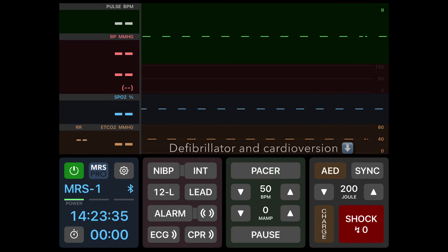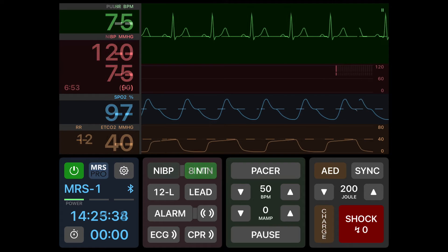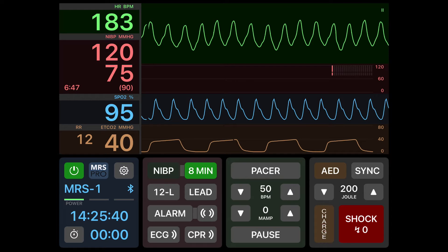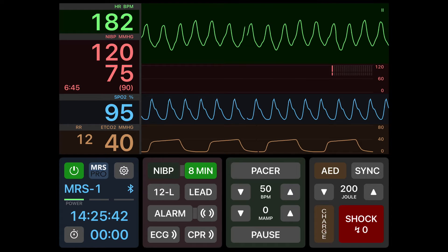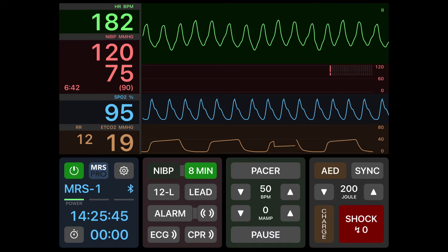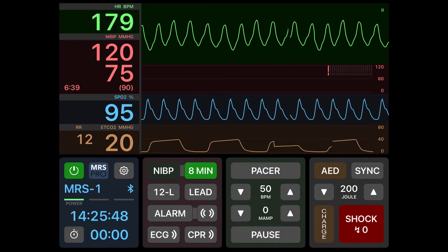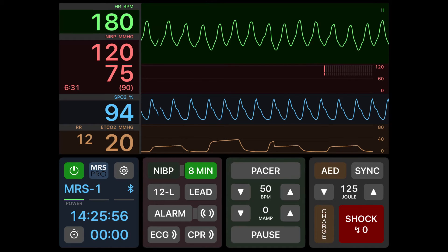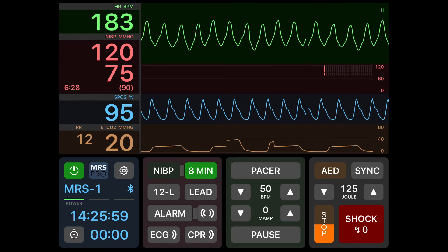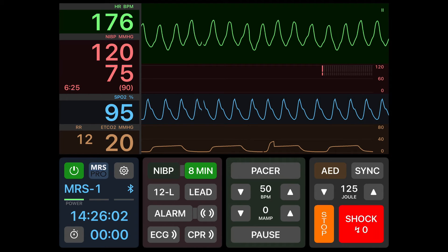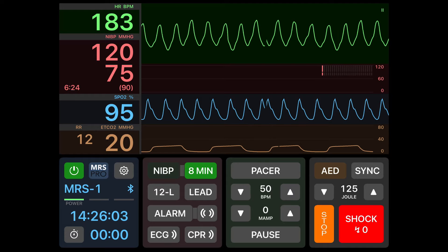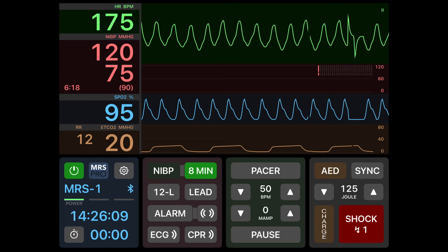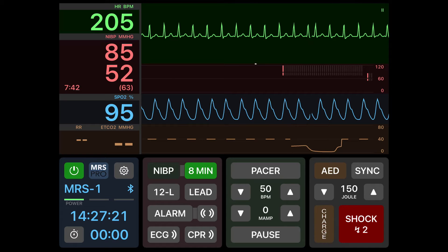To the right of the pacing section is the defibrillator and cardioversion controls. To use the defibrillator in AED mode you would push AED. Otherwise you will manually change the energy selection by pushing the up or down button. Once you select your energy for defibrillation, hit the charge button. If you make a mistake, you'll notice the charge button becomes a stop button. If you have the correct energy selection, push and hold the shock button. You'll notice that once you push the shock button a tally of how many shocks is kept inside of that button.